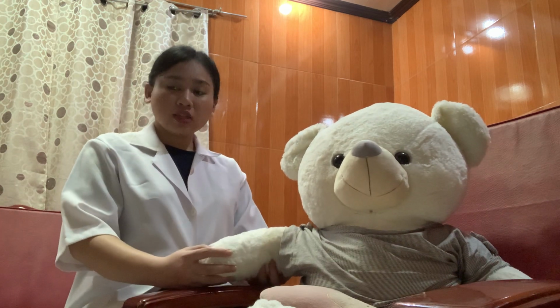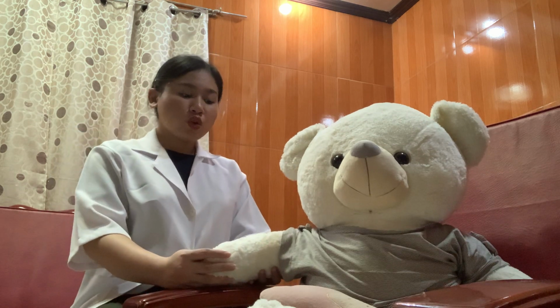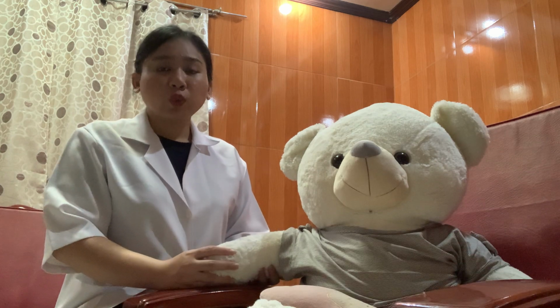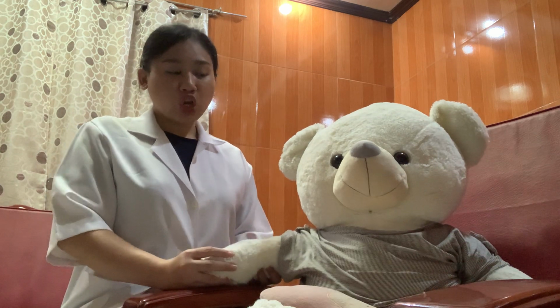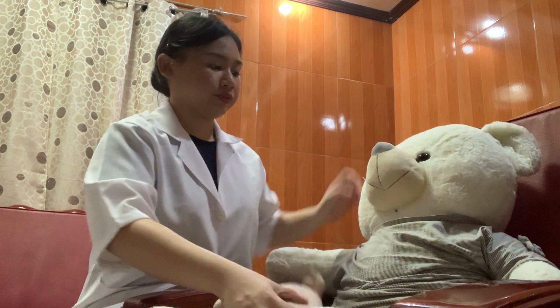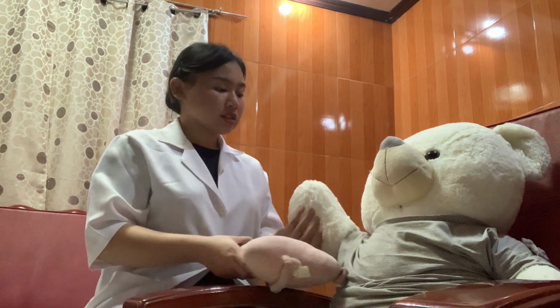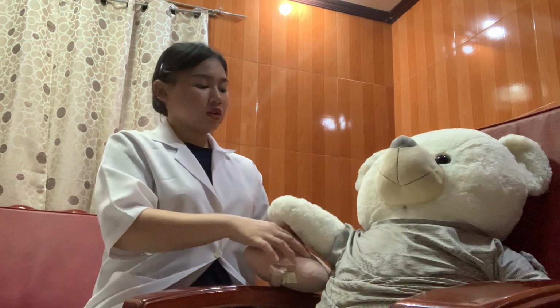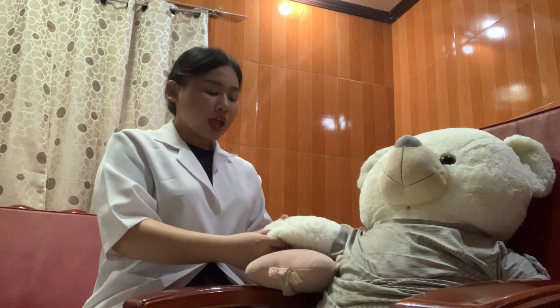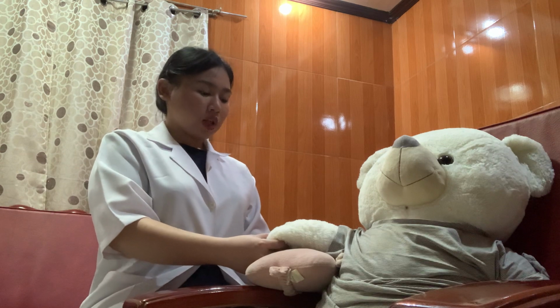Next we position the patient. For the radial artery puncture, we use a semi-recumbent position, and then elevate and dorsiflex the patient's wrist slightly with a small pillow, and then rotate the patient's hand if the pulse is palpable.